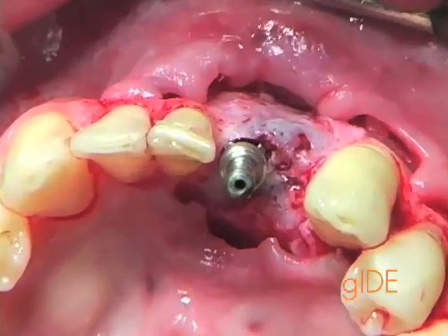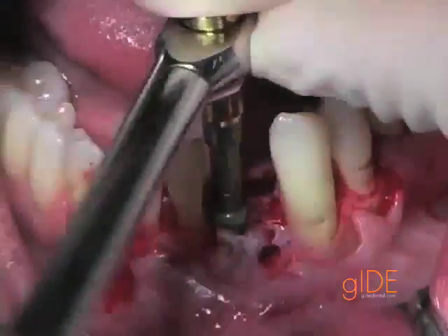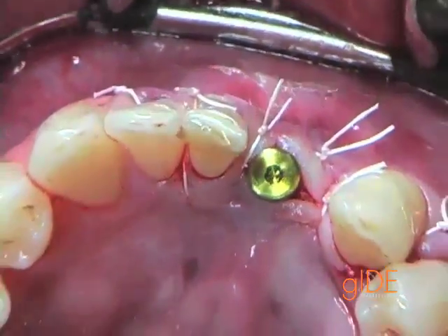Here the final view shows the amount of bone on the buccal. Now looking for the proper vertical position, and we are going to be waiting for this patient to go through an osseointegration period of probably about three to four months.